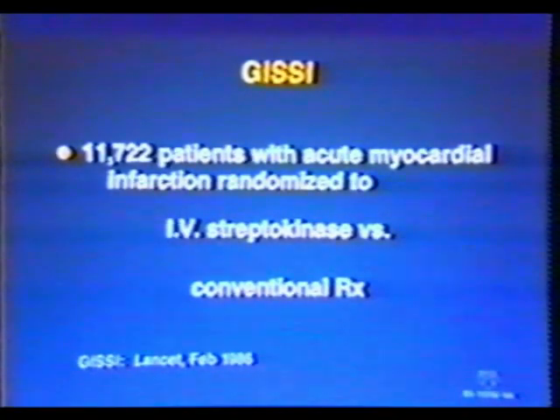Since the wall motion score index helps to fully define the infarct patient's risks, it serves as a backdrop not only for triage decisions, but for a wide variety of clinical management decisions that are made throughout the hospital stay and beyond. None of these decisions is more important than that regarding acute interventional therapy.